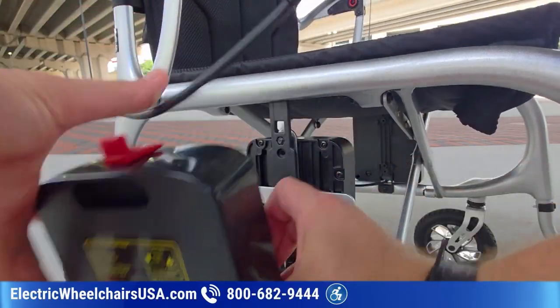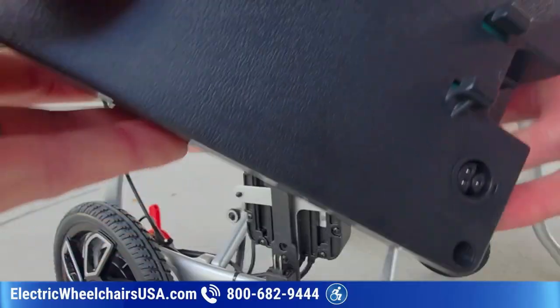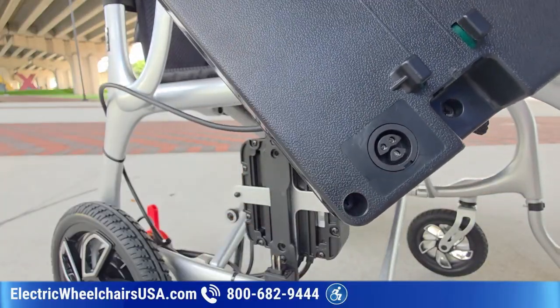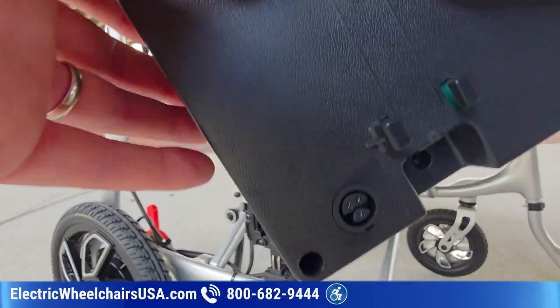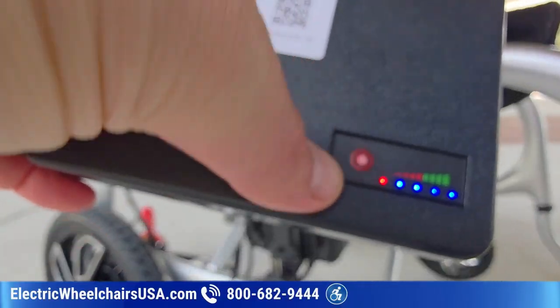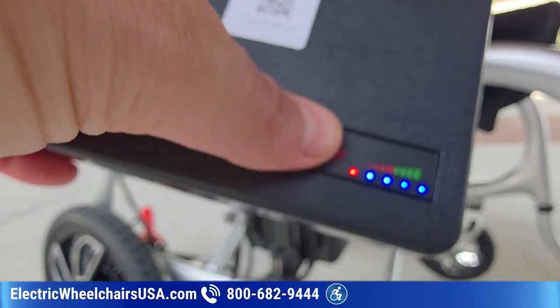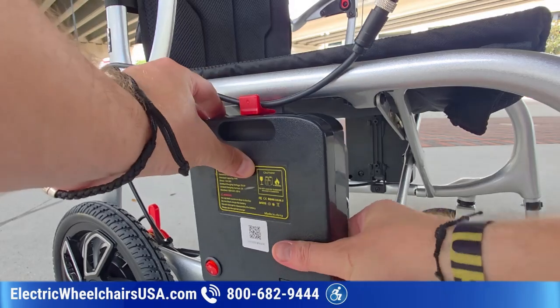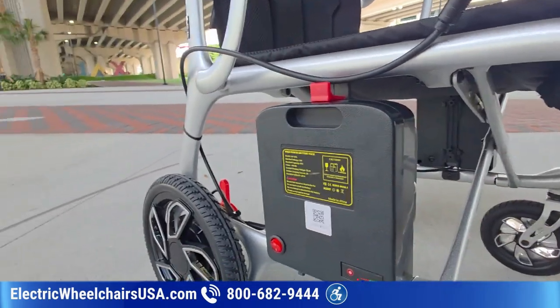Now, as far as the battery, I'll just remove it, press this red lever, and it comes right off. And here's the charging port that's on the battery pack itself, so if you wanted to bring that inside your home. And when it's fully charged, you can just press this button and these lights will light up. You can see right now it's fully charged, so you'll know when the batteries are charged, and then you can put them back on the chair.